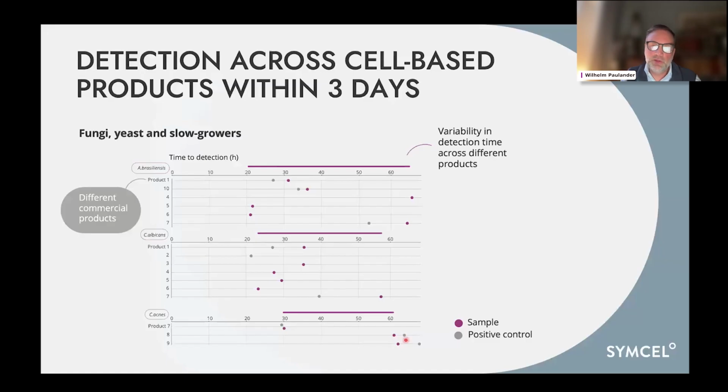That means if you have 1 or 2 more cells for C. acnes, since they have a generation time of 4 to 5 hours, that can have a quite large random effect. But for the rate-limiting organism C. acnes, we actually see almost no negative effect of adding the sample to the system.